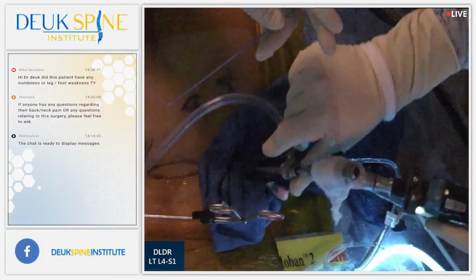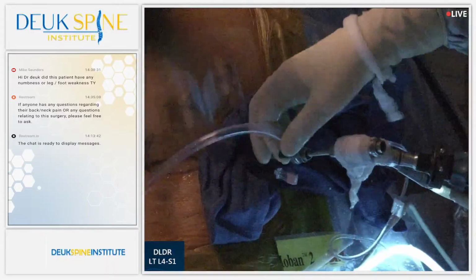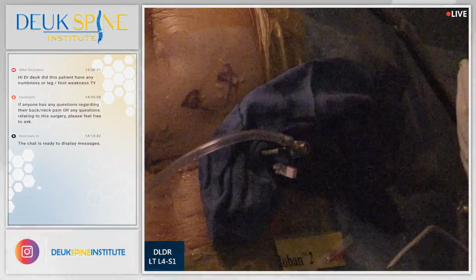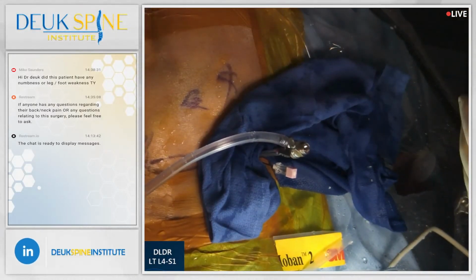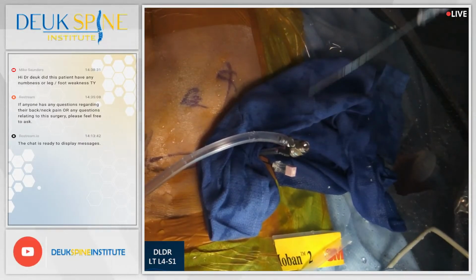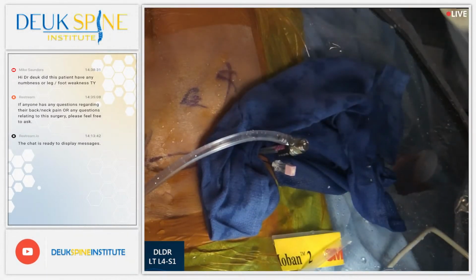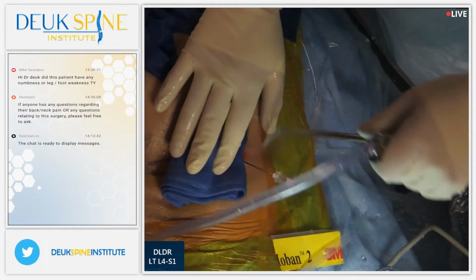All right, there we go. We're out. And there it is. Good. Looks good. Go on, please. Thank you. So we never get 100% of the disc. We always get 50, 60%, which is all we need. There is no surgery in the world that will get 100% of the herniation.